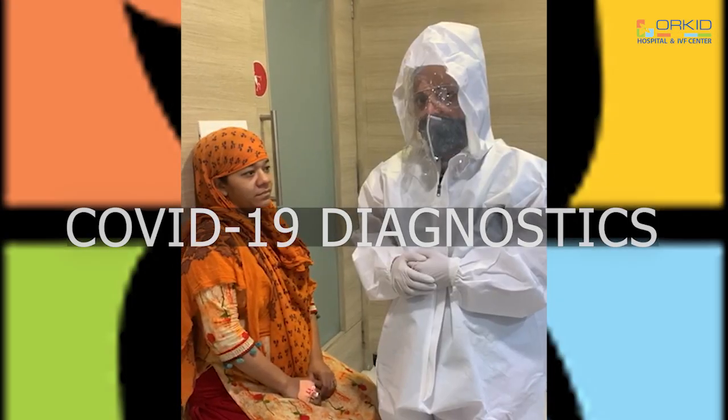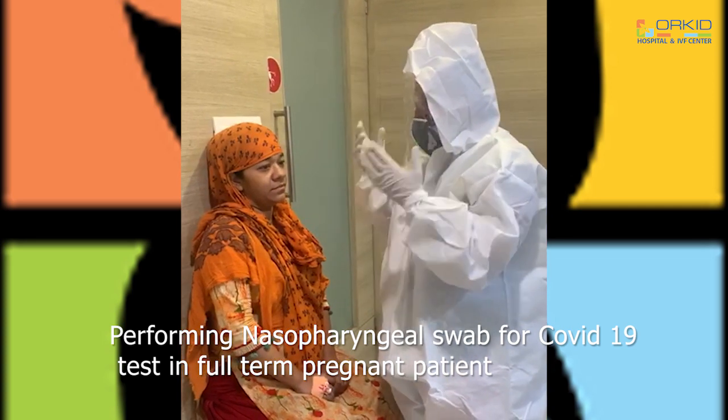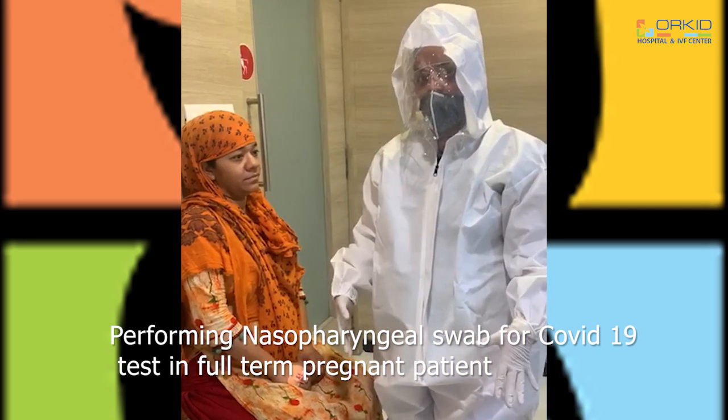I am going to show you COVID-19 diagnostics — how to take a nasopharyngeal swab in a full-term pregnant patient.